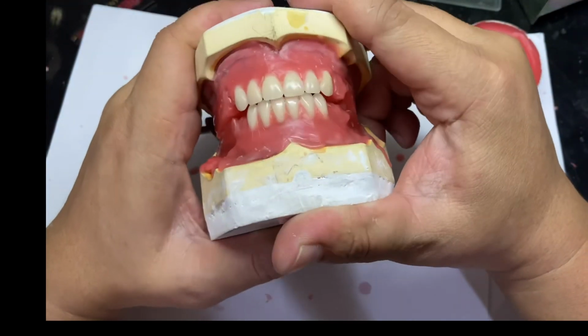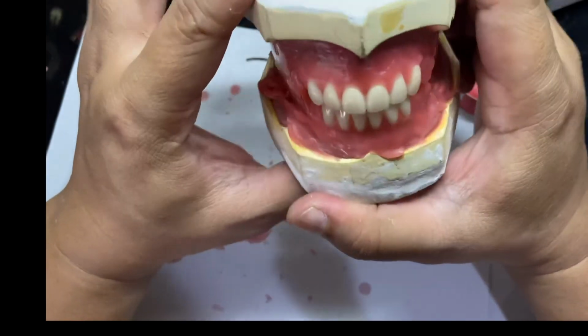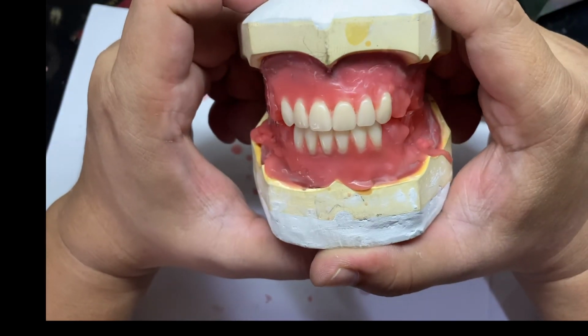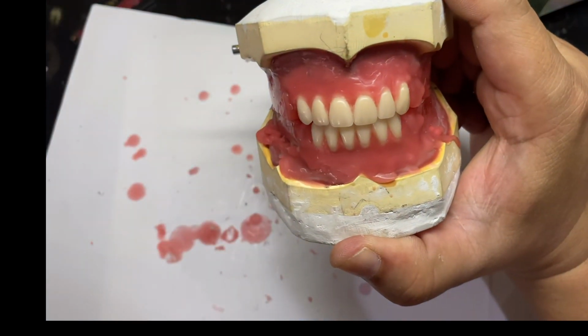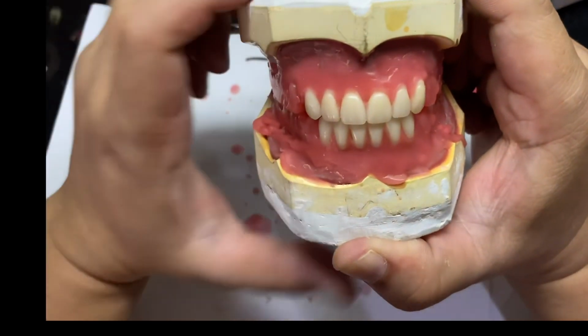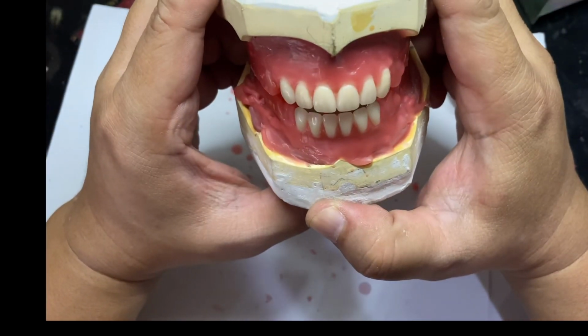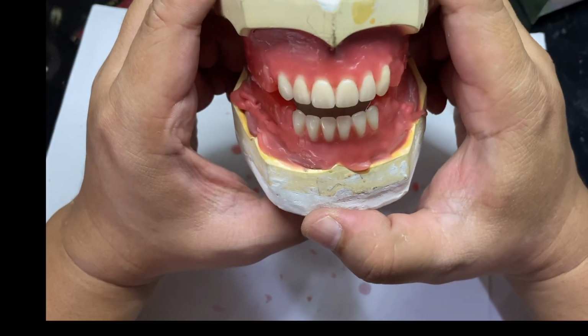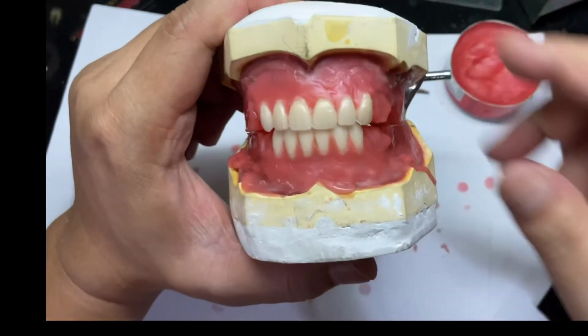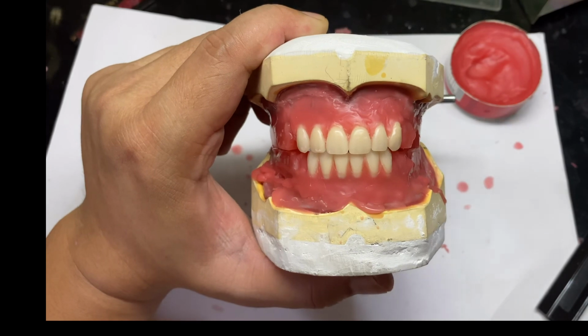So we're done with anterior setting. The next procedure is anterior try-in inside the patient's mouth. If there would be any adjustment, then you may adjust the setting. But if there's none, then we may now proceed with the posterior setting. So that's going to be my next presentation, the posterior setting.